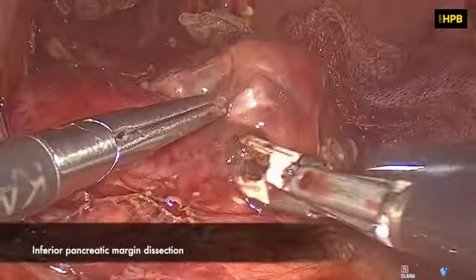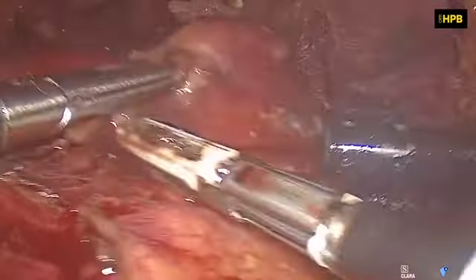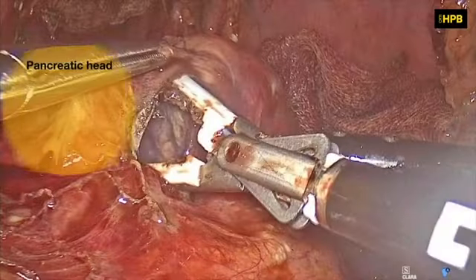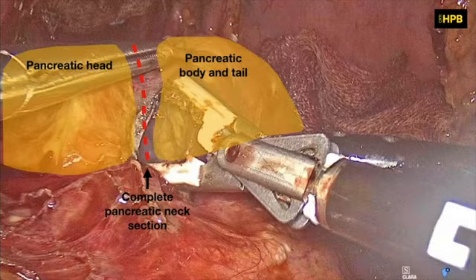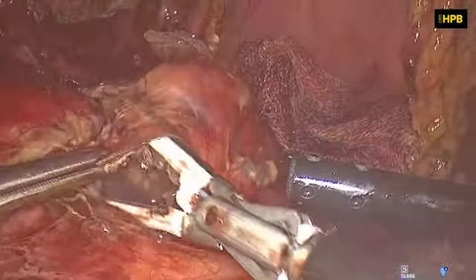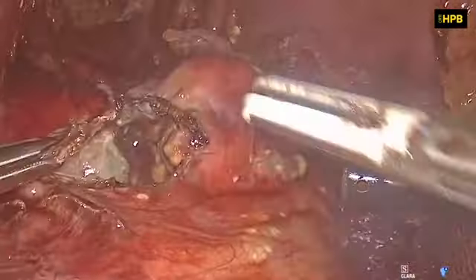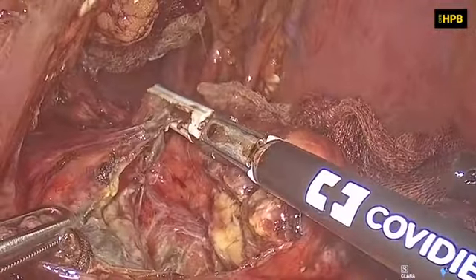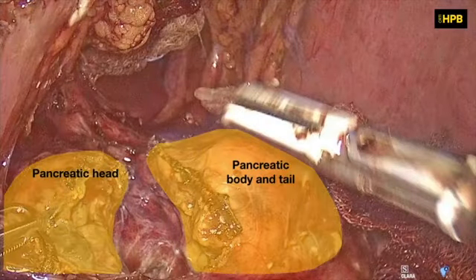In the next step, the lower edge of the pancreatic gland was dissected at the level of the pancreatic neck, confirming a complete section of the pancreatic neck that matched with the findings described in the abdominal CT scan. Pancreatic section was completed with bipolar coagulation, being the anterior face of the mesenteric-portal confluence exposed.